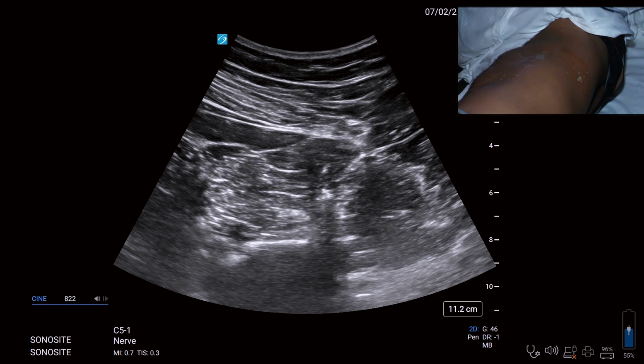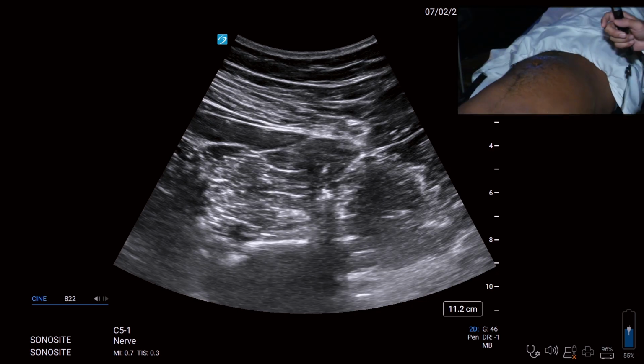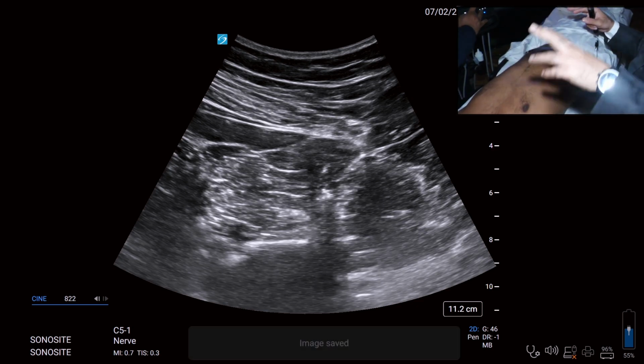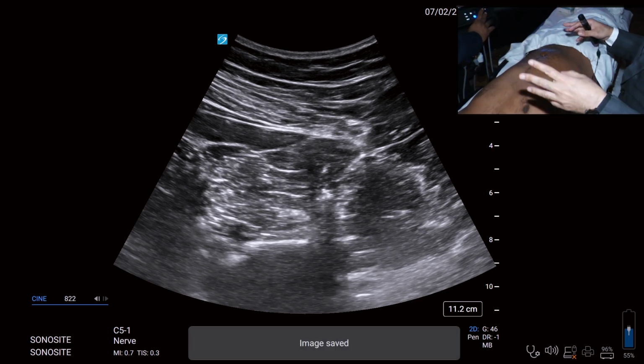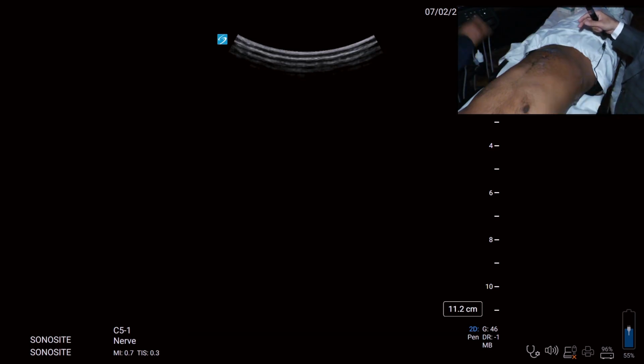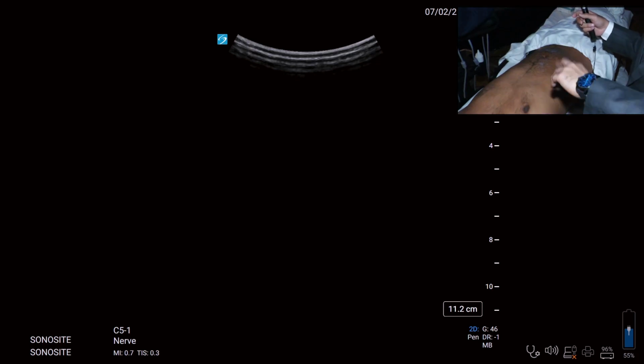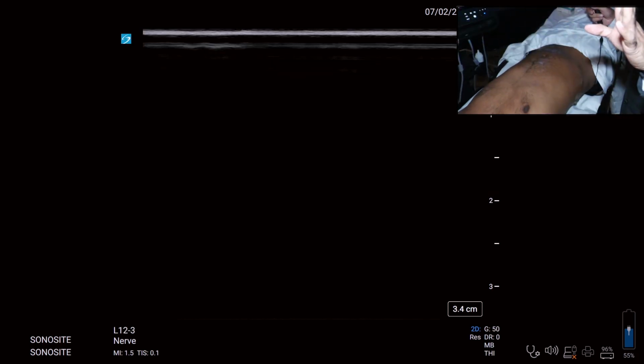So can we get him supine? Straighten him, and linear probe. Now I'll show you the external oblique intercostal fascial plane block. This will finish our trunk blocks as well as the abdomen in its entirety. The popliteal sciatic we have already covered. Now we'll switch over to the lower limb after this and then come back to the upper limb. It's 11:30. We still have 1 hour. So any other particular block, if you are interested in knowing.